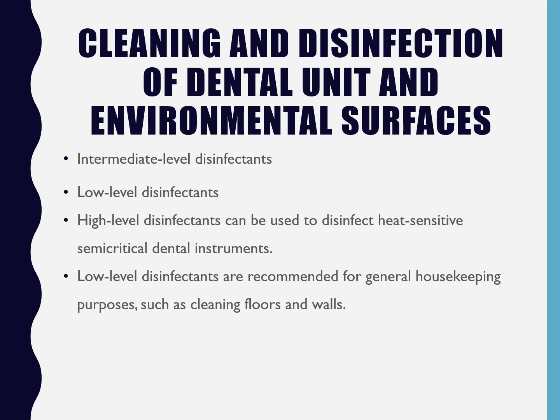Sometimes, especially with dental radiology, the beam alignment devices or the film holders that you use are semi-critical, and so they do need to be sterilized in between uses. And so sometimes they are not safe to put into the autoclave, and the office that I worked at used a kind like that, and so they needed to go into a cold sterile.